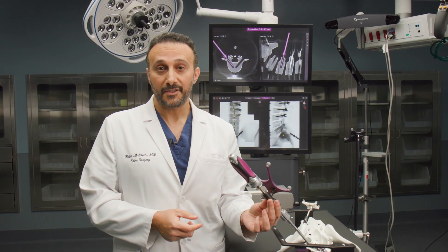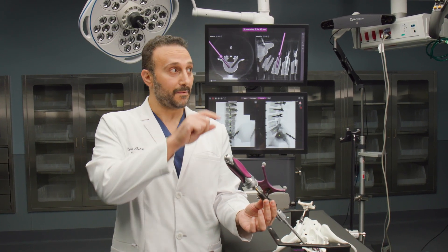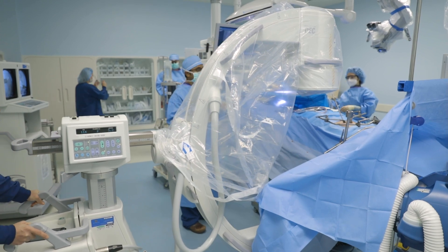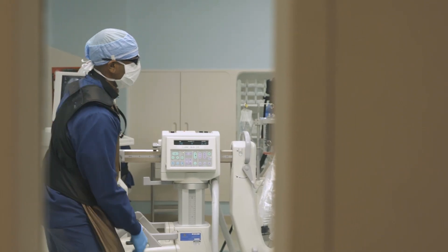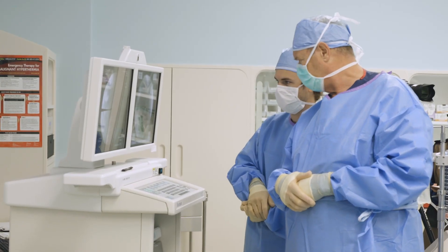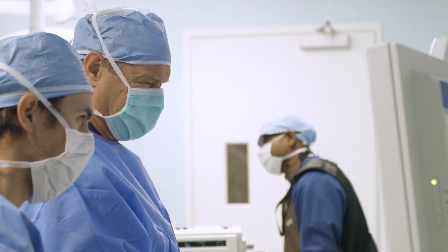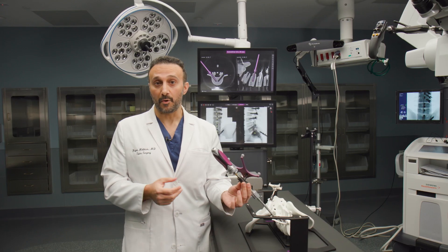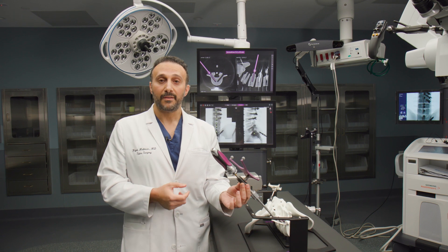Prior to having this technology, what we'd have to do is use an x-ray machine that would be here over the patient, and we'd have to take some x-ray images as we put the screw in to know exactly where it was in space, and then check it again to make sure that it was not in an area where it'd be irritating any of their nerves.